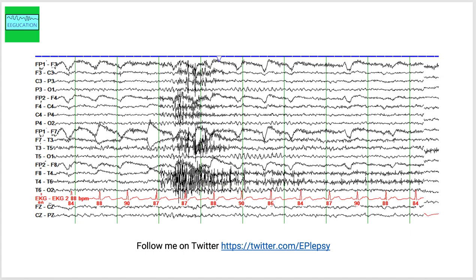So just a brief introduction about EEG. EEG basically records the excitatory and inhibitory postsynaptic potentials. We amplify the signal from the brain approximately a million times so that we are able to see it on the monitor here.